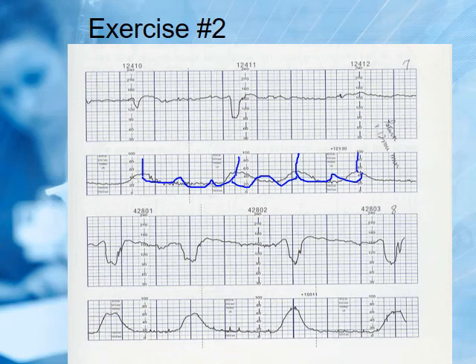10, 20, 30, 40 seconds there. 10, 20, 30, 40, 50, 60 seconds there. So they're about every 2 to 3 minutes, lasting about a minute. Okay. Now tell me about the heart rate. What's your baseline? 150. What's your variability? Wiggliness? I'm going to say kind of minimal. 3 to 5 beats per minute changes.